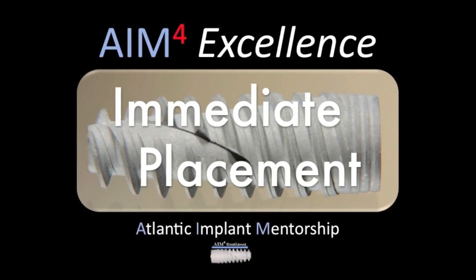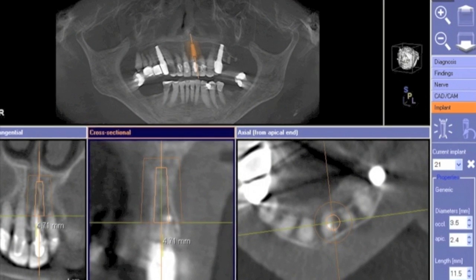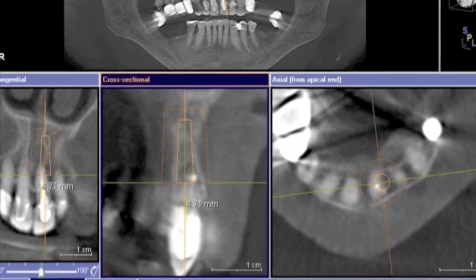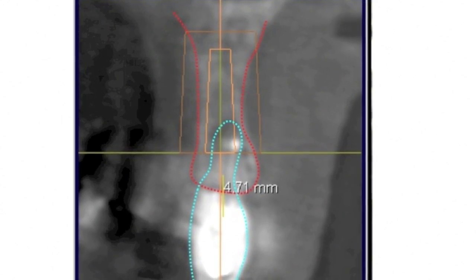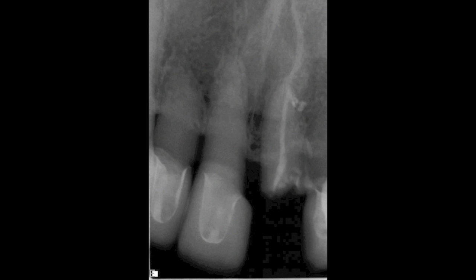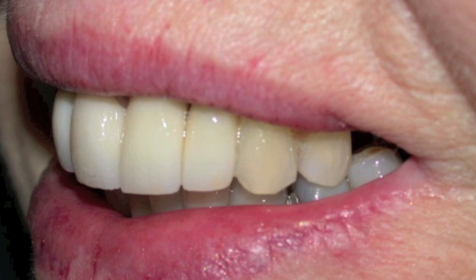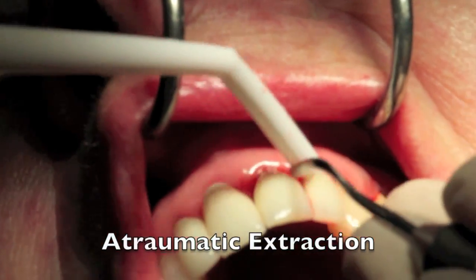For today's patient, we have an 80-year-old who requires the replacement of an upper left central. So we're going to do this with an immediate placement type of protocol. The patient did present with the crown off, and then we actually cemented this back on. As you can see in the X-ray, there's not a lot to work with to restore this with a typical post and core. So we wanted to do an atraumatic extraction, so using a periotome.